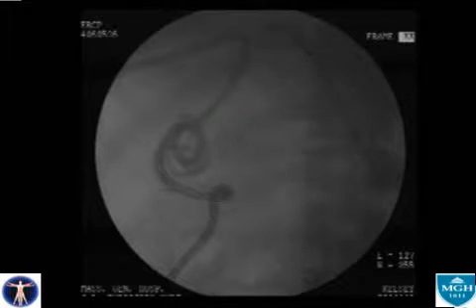jejunal limb. The cholangioscope was passed first into the jejunal limb in an attempt to visualize the anastomosis. While conceptually a good approach, in practice it was very difficult. While the scope easily entered the limb, air used to insufflate the region simply bubbled away rather than distending the area. Therefore, no stricture could be visualized.